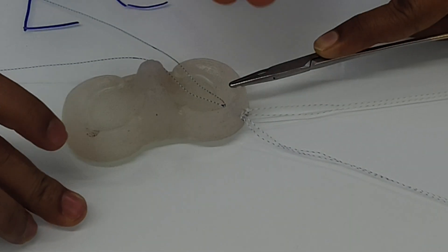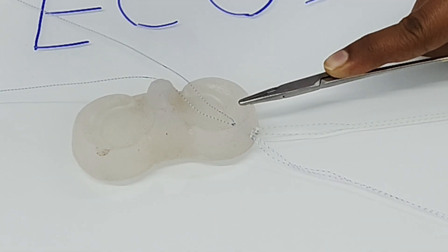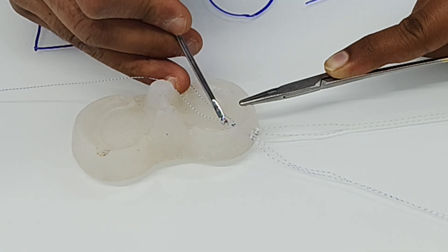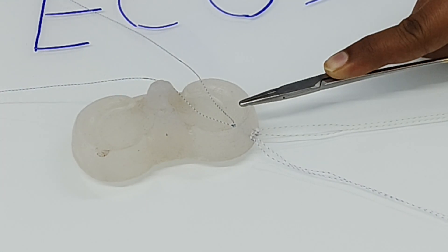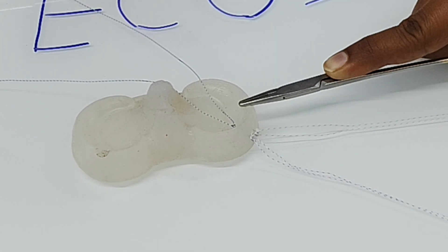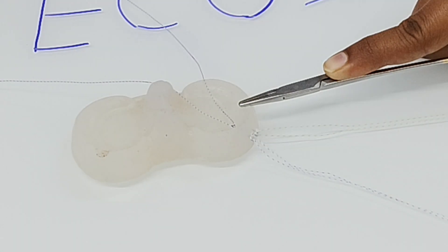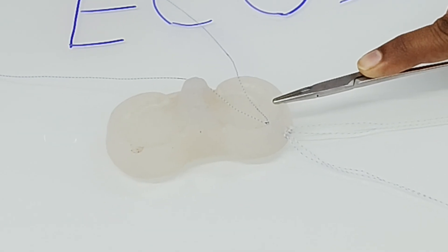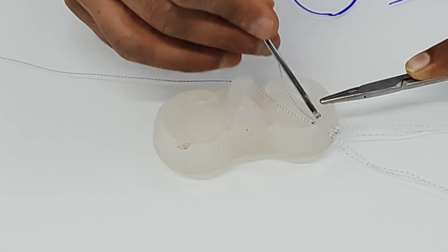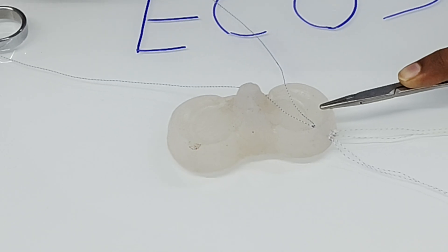Another key difference compared to other all-inside suture repair devices is the thread thickness. In other all-inside meniscus repair devices, the thread is either a 2-0 or 1-0. Here the thread is number 0, which is larger, leading to a more secure fixation of the meniscus. Once done, ask for scissors to cut the thread from outside.